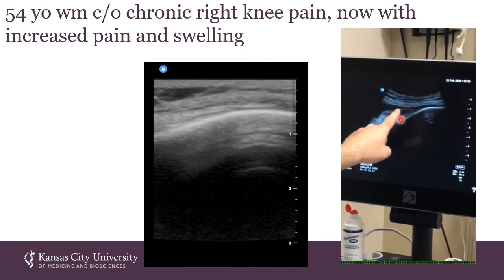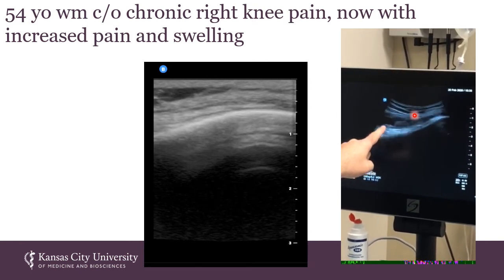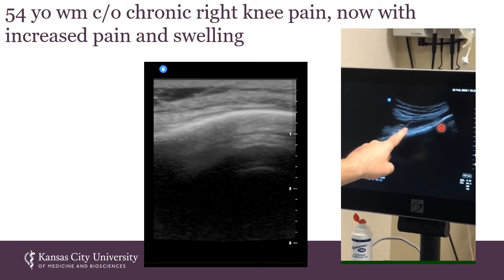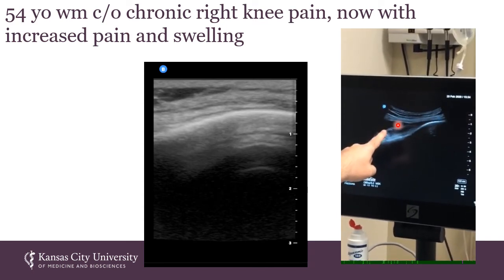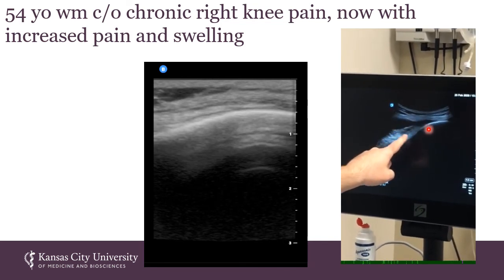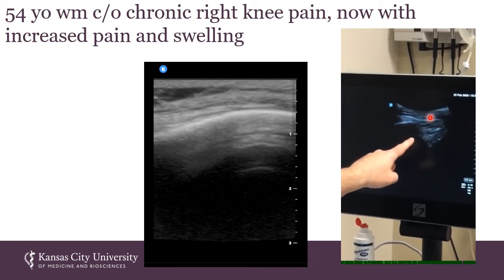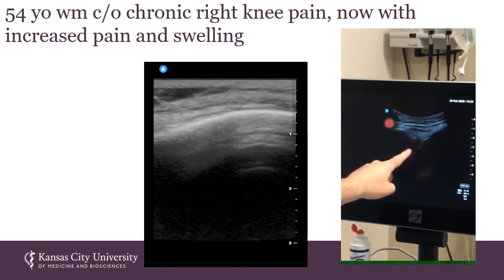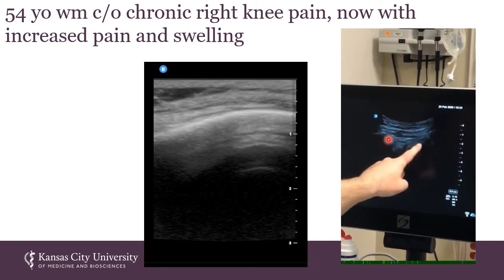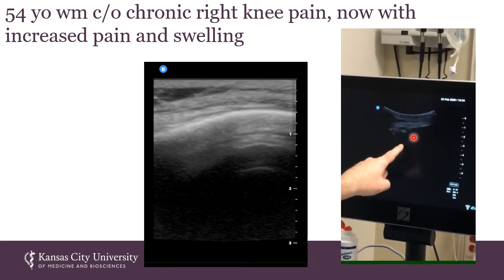There's a little bursa there, but here's his femoral condyle, and there's his patellar tendon right there coming along, okay? And so anyway, yeah, he's got a lot of fluid in his knee joint. So if you did need to do a tap, you could do it with ultrasound, but you could check before and make sure there's a lot of fluid there, and you could do it blind if you wanted. Now this is the distal end of his femur, and here comes his tibia into view down here. So this is the tibia coming in down here.